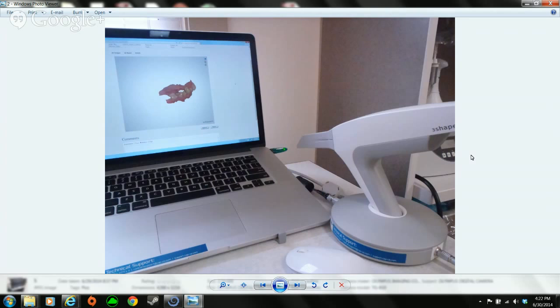is according to whether you're going to buy the 3D printer yourself or you're going to pay someone else to print the guide for you. But most people will charge you about $30, $40 to print the guide and the model, and the rings from Blue Sky are like $5 a piece. So it's very feasible to make a guide for $50 to $60, even if you outsource the printing. And the average price for a surgical guide that most labs charge is $250 to $350. So a 5-times markup is normal.